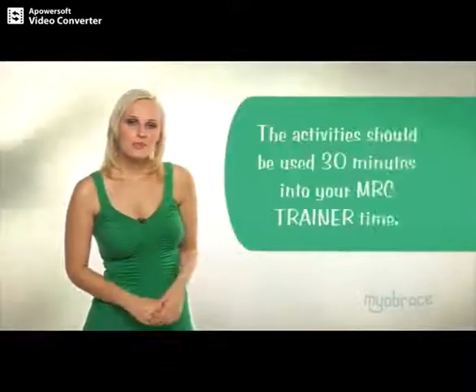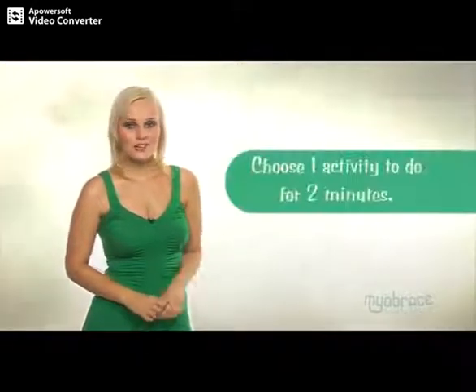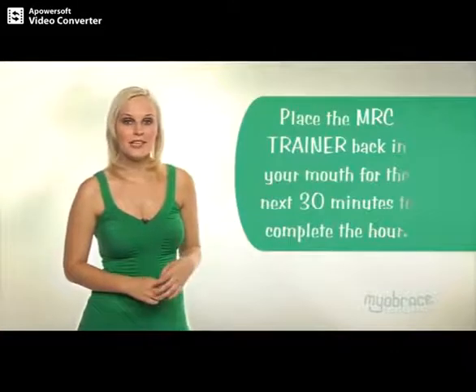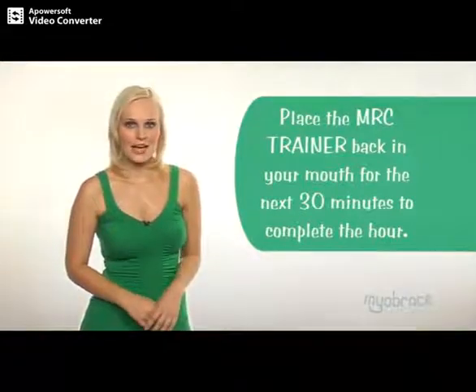The activities should be used 30 minutes into the hour of MRC trainer time. After 30 minutes, take out your MRC trainer and choose one activity to do for two minutes. Then replace the MRC trainer into your mouth for the next 30 minutes to complete the hour.